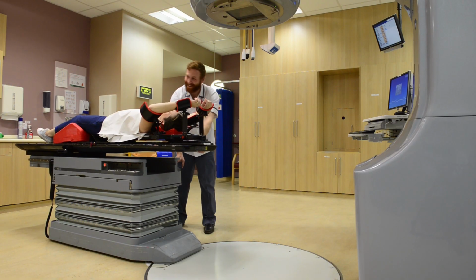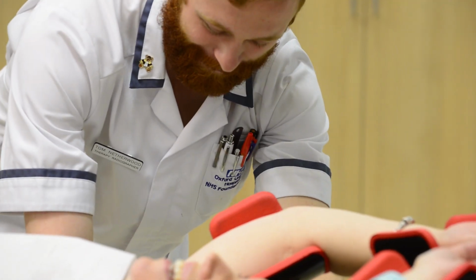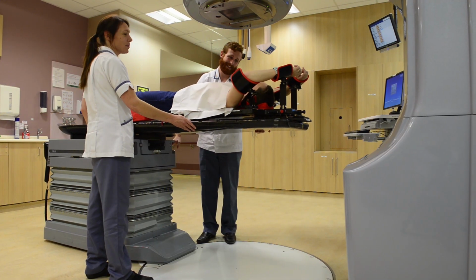The first time you do it, there is an element of I'm naked, but everybody is so nice and so friendly, and you know it's what they're doing every day, and that they're there to do that specific task for you, that after a while you forget that you don't have any clothes on, really. We do have to have you remove your clothing so that we can see the permanent marks that the pre-treatment staff have put on you. But also, the radiotherapy will react with metal, so we ask you to remove any necklaces, and the metal within the bra would also cause a reaction, which we want to avoid.